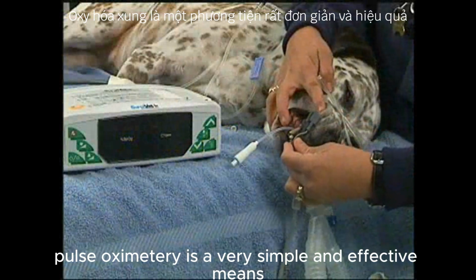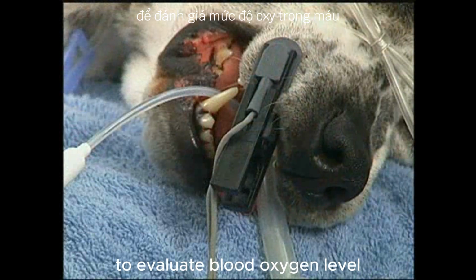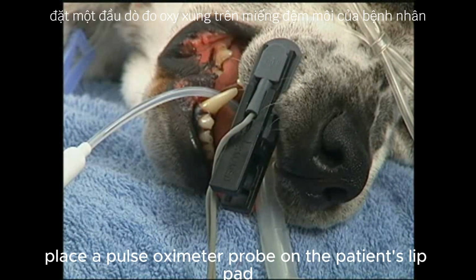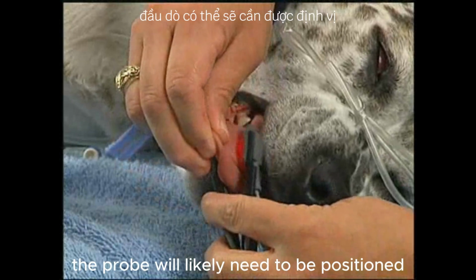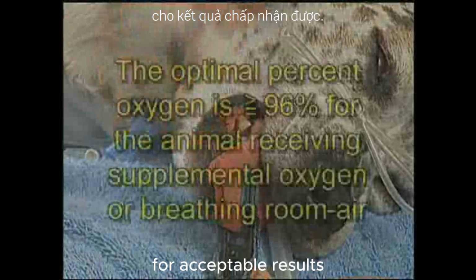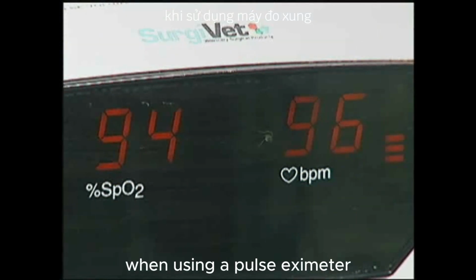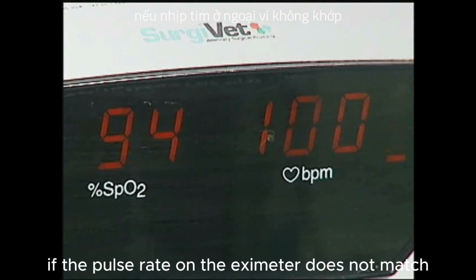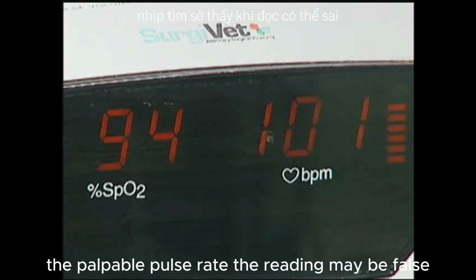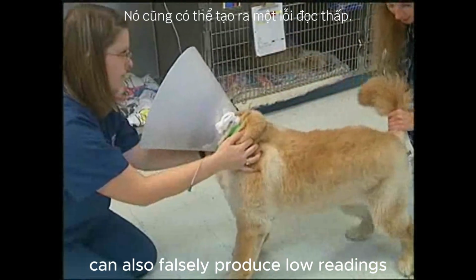Pulse oximetry is a very simple and effective means of measuring the patient's blood oxygen level. To evaluate blood oxygen level, place a pulse oximeter probe on the patient's lip, pad, rectum, or femoral artery. The probe will likely need to be repositioned for acceptable results. When using a pulse oximeter, be sure to take a palpable pulse rate. If the pulse rate on the oximeter does not match the palpable pulse rate, the reading may be false. Low body temperatures and dark pigmentation can also falsely produce low readings.